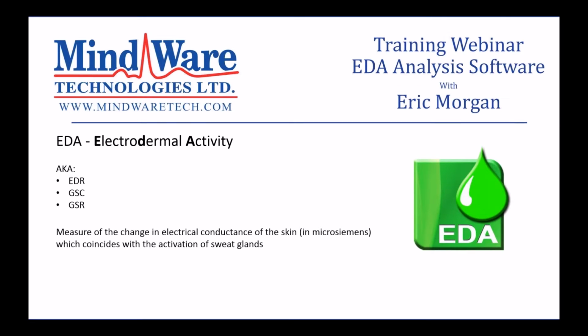What we're measuring with EDA is a change in the electrical conductance of the skin, which is measured in microsiemens. And this change in conductance coincides with the activation of sweat glands. Typically, EDA is collected with 2 electrodes on the palm of the hand, but you can measure EDA several places on the body, the soles of the feet, the fingertips, but the palms of the hands are particularly good because of their high concentration of sweat glands.